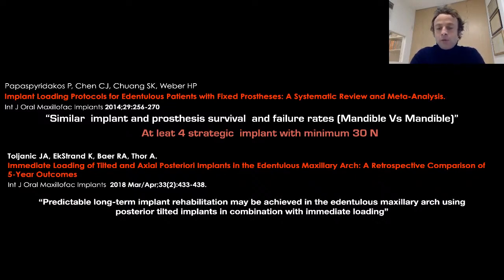But honestly, when we work in the full edentulous patient, we can do immediate loading also with implants that are 20 Newton, because first of all, 20 Newton is still a good value of primary stability, and at the same time, when we splint together all the implants, this aspect achieves less importance than when we do the immediate loading in case of single implant placement.